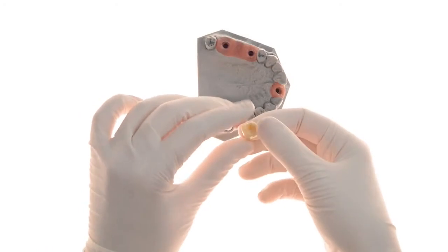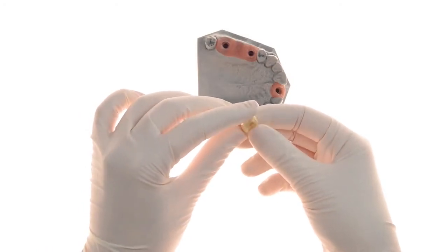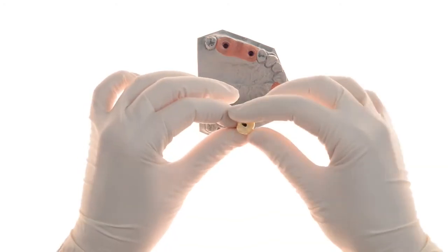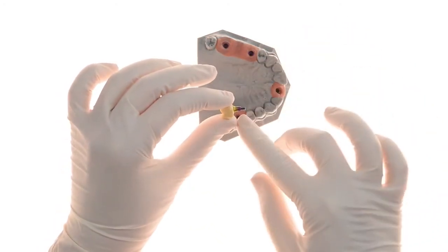Here you can see the crown prior to being cemented to the EasyBase. After cementation, the crown may be inserted into the implant and screwed into place.